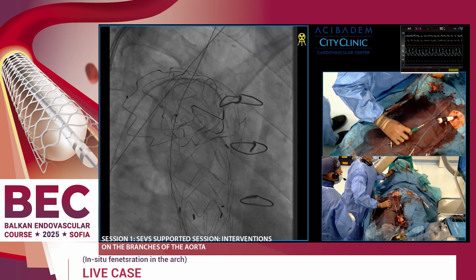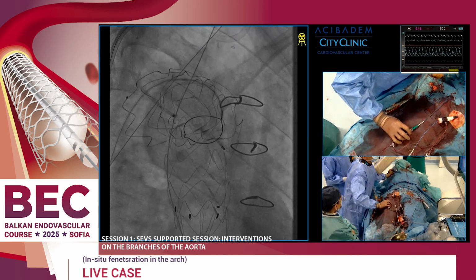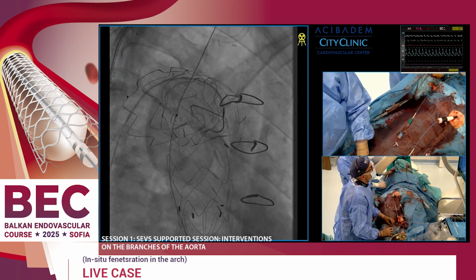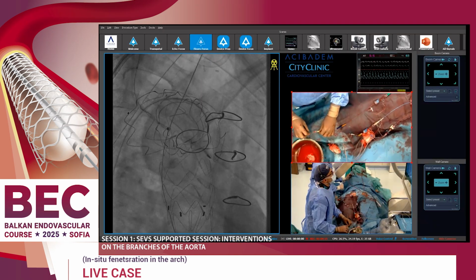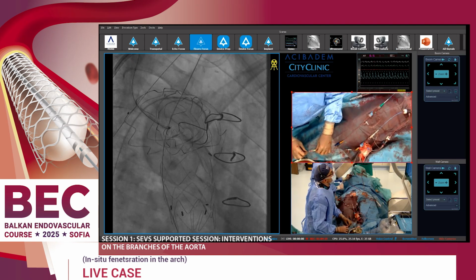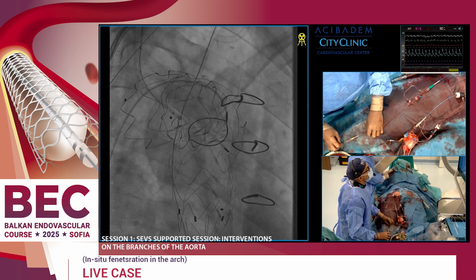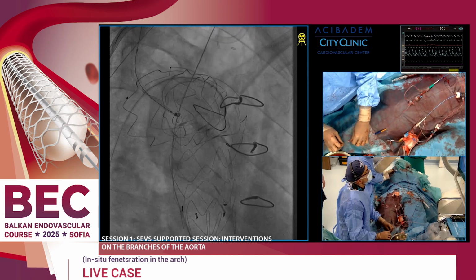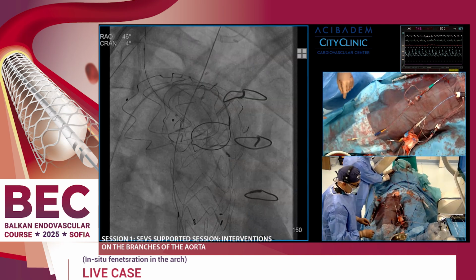So it's like endovascular. It mimics the frozen elephant trunk technique, which can be performed with the Thoraflex, which keeps the catheter in place. So we're using it now on a large scale. Look better. I think it is. Go left.